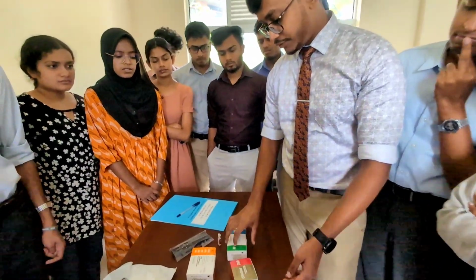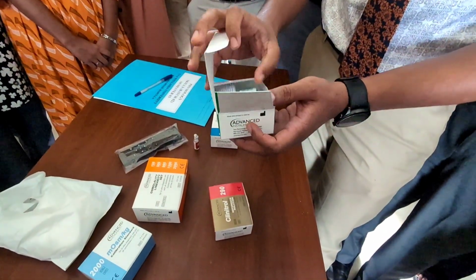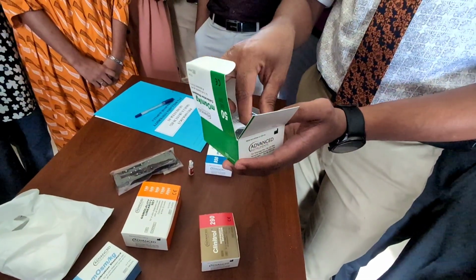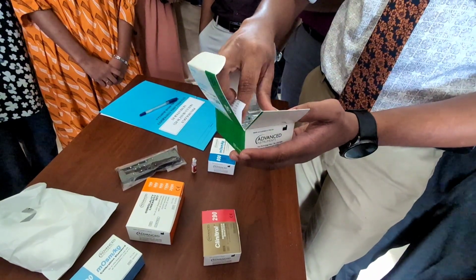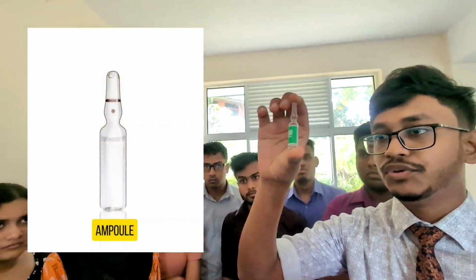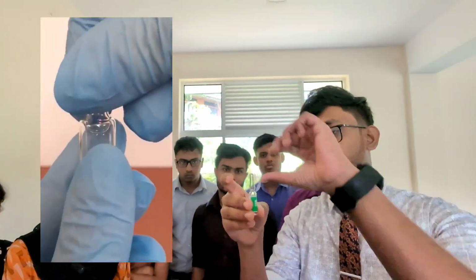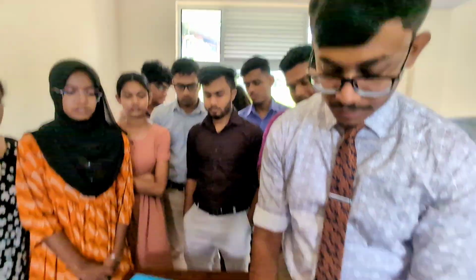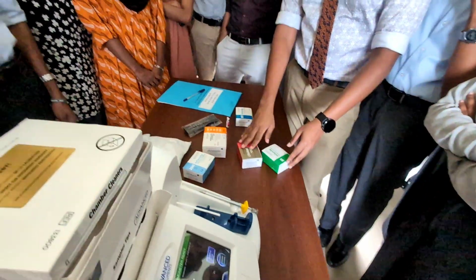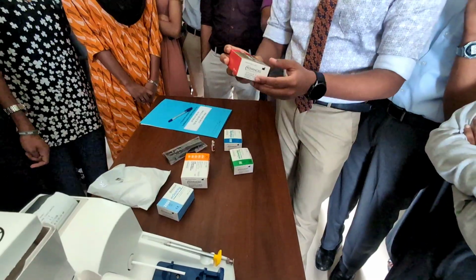So if I open one of these, they come in ampules. Do you know what an ampule is? So this is basically an ampule. You will see these things in the ward more often. These are made of glass. You basically snap it open, and so these are the calibration sets, and this is the reference solution.